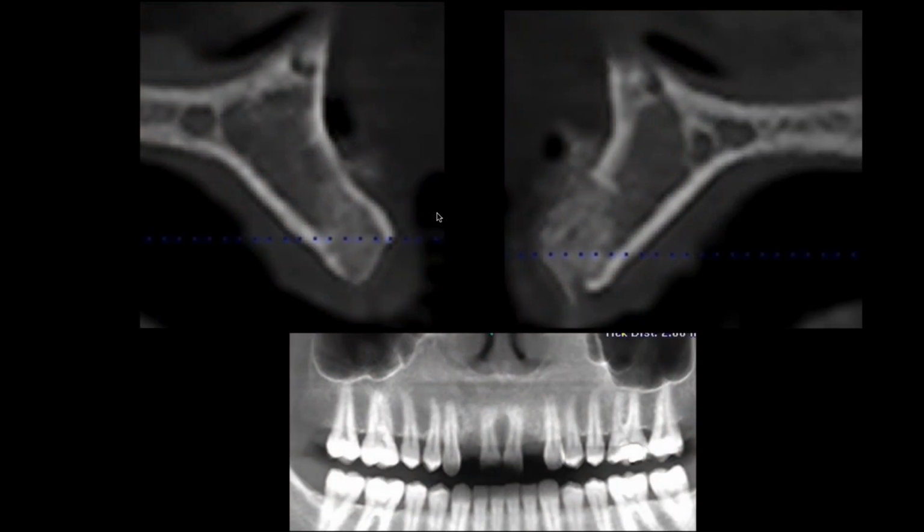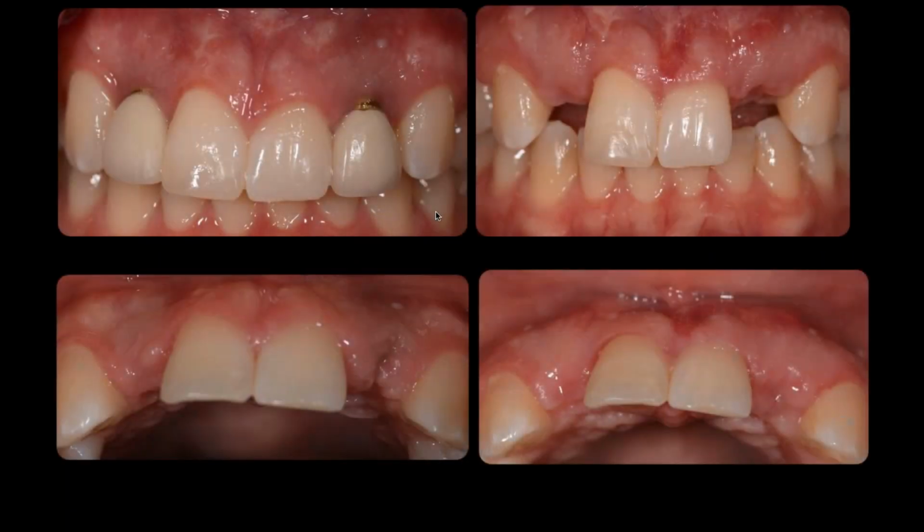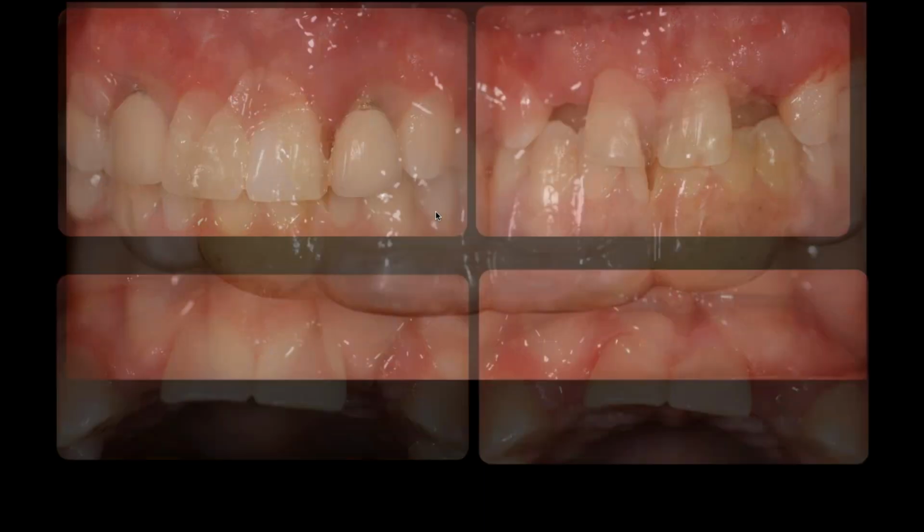It looks pretty good. That's the immediate post-op. So I think we've achieved the beginning part of a reconstruction. Now what you see here on the left is before, and on the right is after the graft. You can see that the tissue now is much more stippled, pink, thick. You're seeing I got a much prettier architecture to it. Now from this, we should be able to do anything we want, and because it's thick, we won't have recession. So that's what we do.